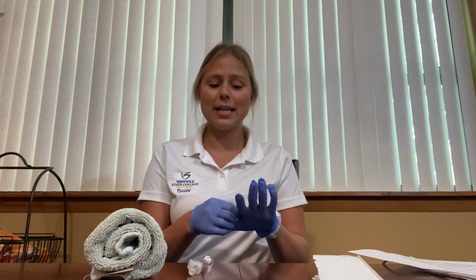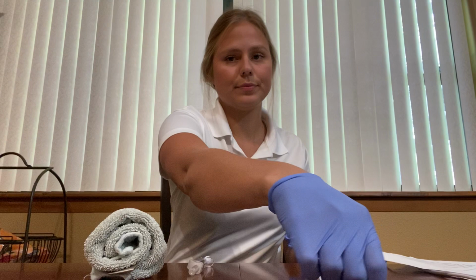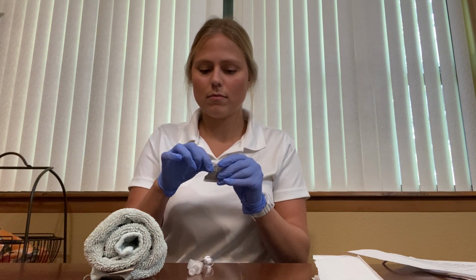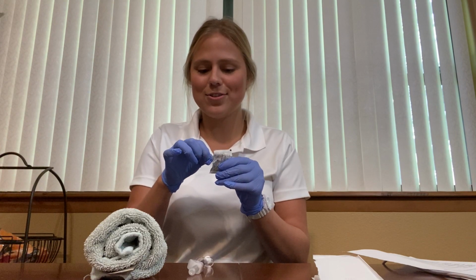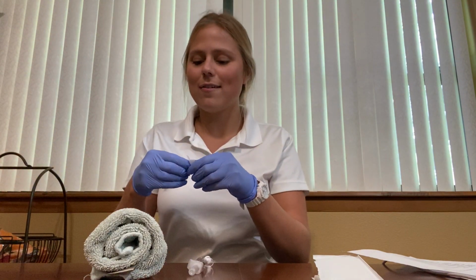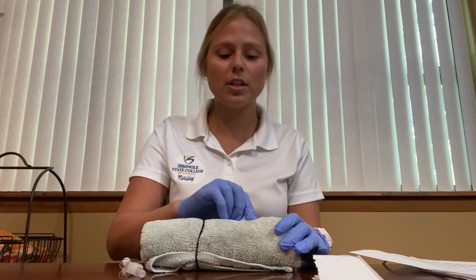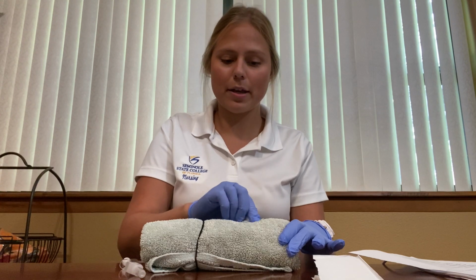And then I'm going to be cleansing my injection site with the alcohol pad. All right. Open this up. And again, I want to cleanse the site for 30 seconds. Can't quite pinch it. There we go. Okay, so I'm going to be opening up my alcohol pad. Cleanse the site. So I'm going to move it in small circular motions, starting at the center, and then slowly working my way out, making bigger circles.